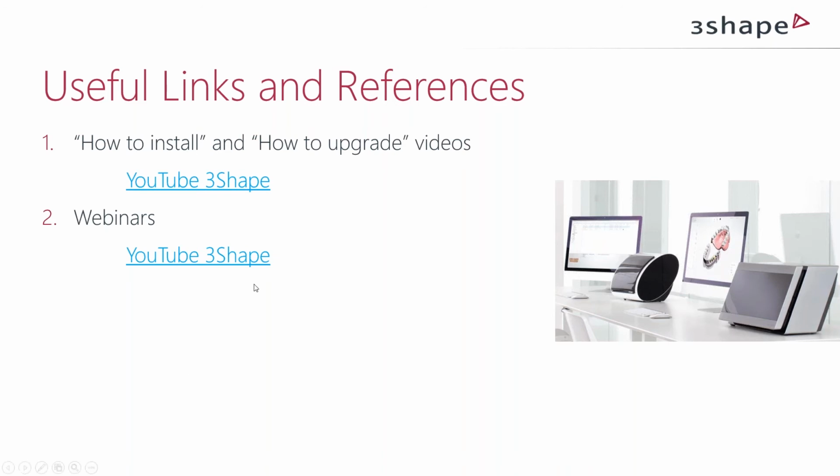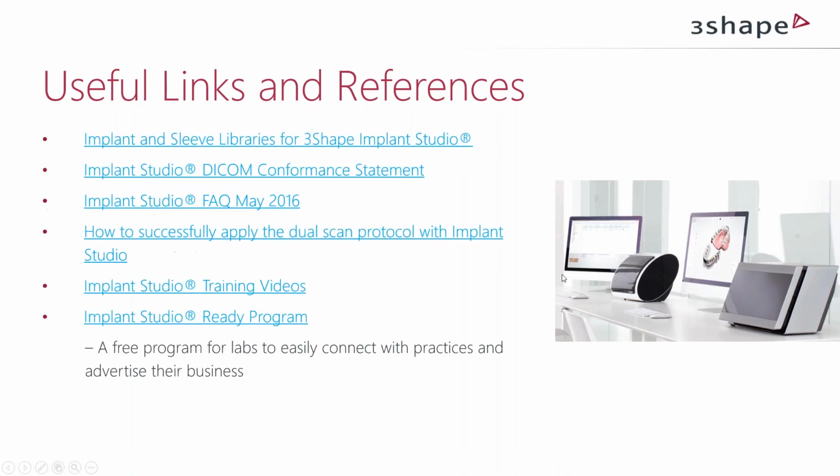How to install and how to upgrade videos are found on YouTube's 3Shape channel. You can also find recorded webinars at the same page. And here are some links to different documents we have, which will help you in your daily work with Implant Studio. The list of implant and sleeve libraries for Implant Studio, then the DICOM conformance statement. These are requirements for DICOM files you load into Implant Studio.